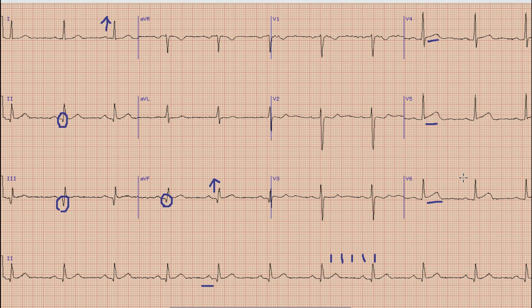First of all, we will rule out early repolarization. Normally, if there is early repolarization, you can find ST elevation in mid chest leads, that is leads V2, V3, and V4. While in this case the ST elevation is present in leads V4 to V6.